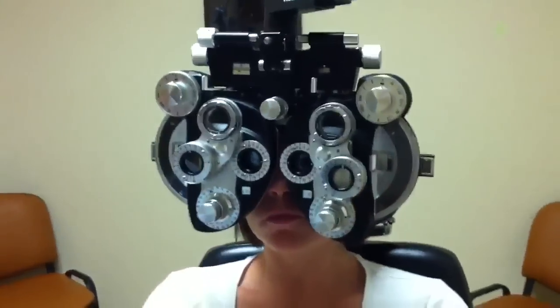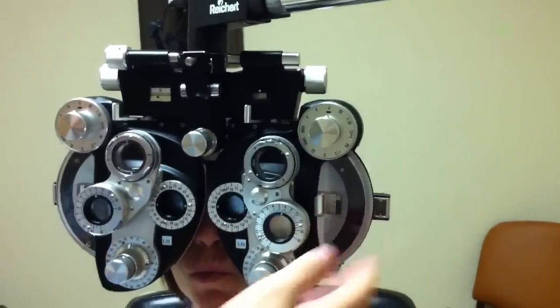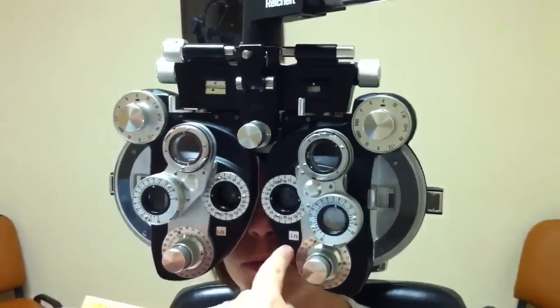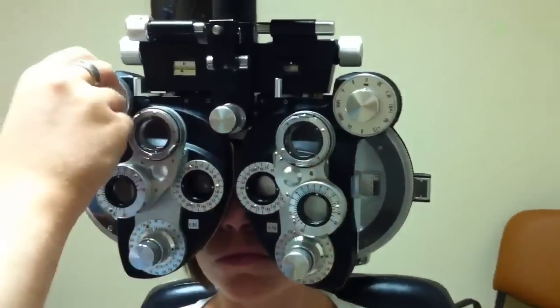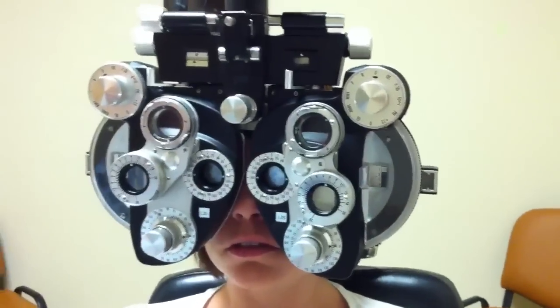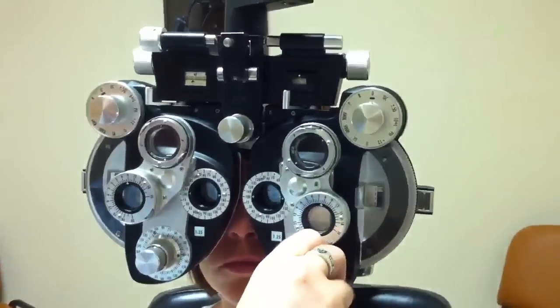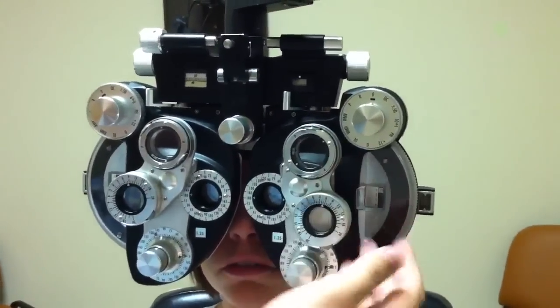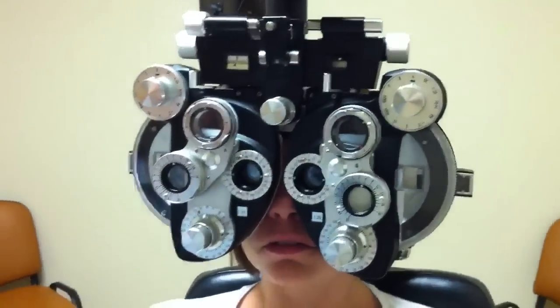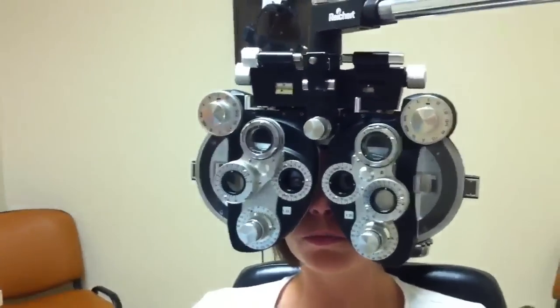So what happened is she wanted one more minus on the left side, but maybe she didn't. I do have a lot more astigmatism on this eye — I may just check that. Does the left eye look okay? Yeah. Pretty clear? No, it's blurry. Is this better? Much better. So maybe she really didn't want that astigmatism — sometimes it's a little hard. Does that look pretty clear with both eyes? Yes. Okay, and that's it.